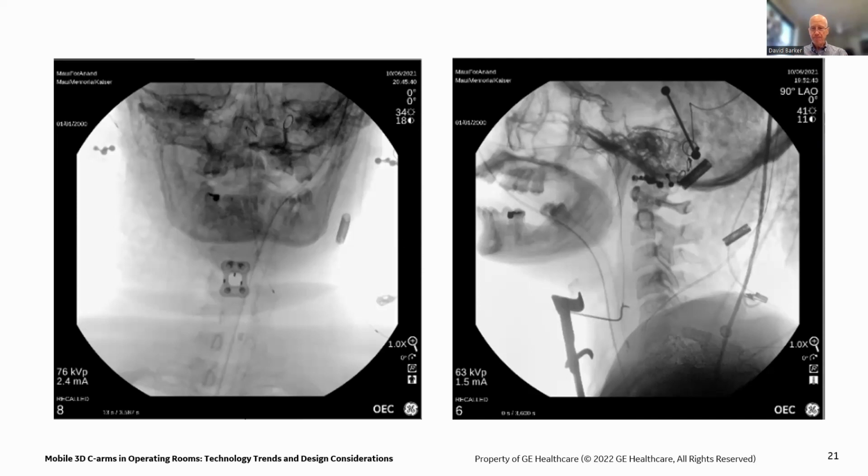Now, even though 3D images add more information, the doctors typically still go back to a couple key 2-dimensional shots for communication and also for quick documentation purposes. So today, there is no doctor who relies 100% on 3D images and never, ever goes back to 2D images. They all require 2D images to get their work done. So that's an important thing to remember.